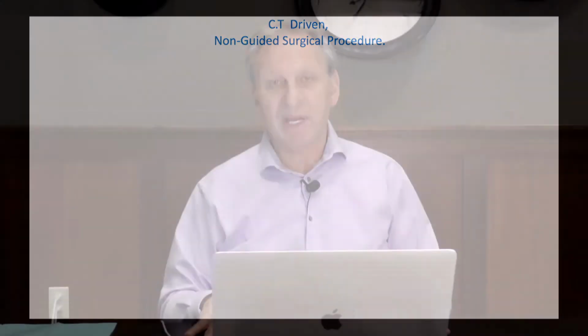I'll be honest, with guided surgery there are a lot of costs and challenges. They're less now than before because the systems are better, well-defined, thought out, and integrated. But there's been a real challenge with guided surgery. If nothing else, the cost of it: having the CT machine, the treatment planning software, all the tools that you need to do guided surgery, wasn't a small hurdle to get over. So to be perfectly honest, until recently, I almost never used guided surgery for a single implant case in my clinical practice, because the cost of it was not a good return on investment in my opinion.